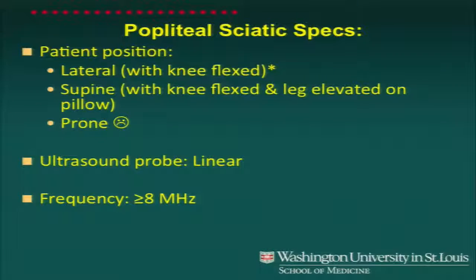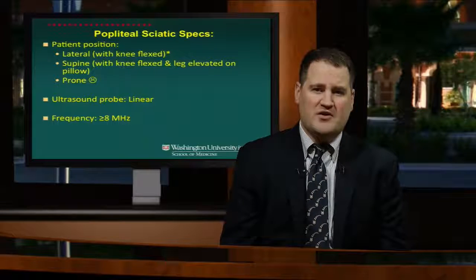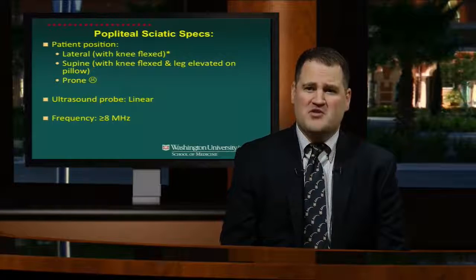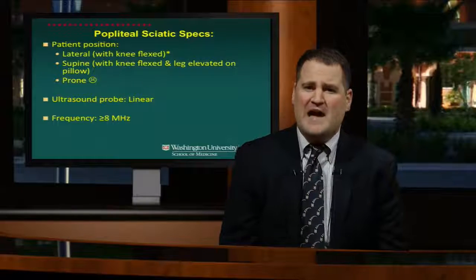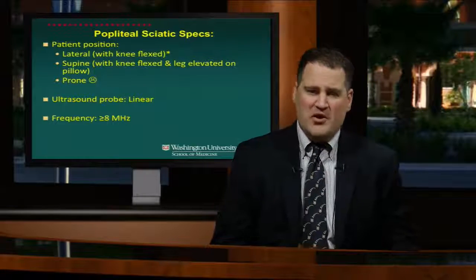Lateral also allows you to keep your arms down further. You're not pushing the probe up like in a supine approach. With a supine approach, typically your down arm, the one that's holding the probe, will get kind of tired, if you've noticed, if you've done a lot of supine approaches to the popliteal nerve. The lateral approach allows you to drape everything out. If you're doing a popliteal catheter, you don't necessarily have to have another person help you with the probe.